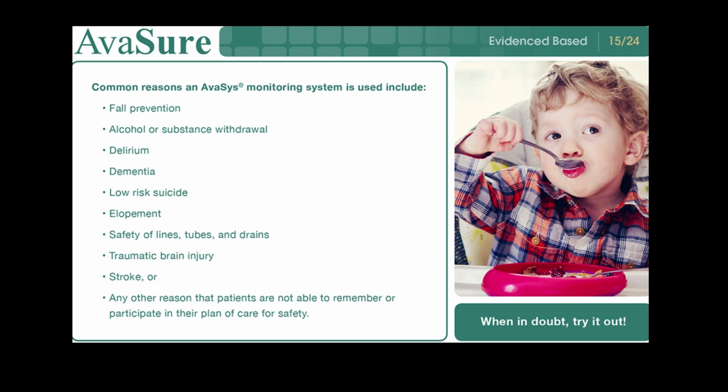When unsure of how a patient will react to video monitoring, it is best to do a trial rather than just assuming it will not work.